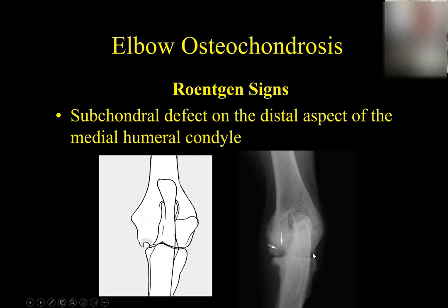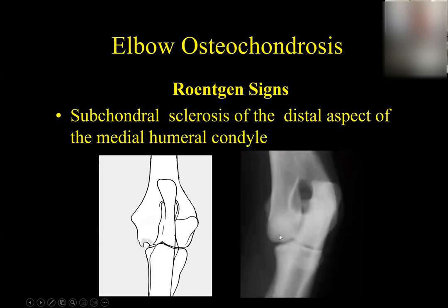Again, you can go in arthroscopically, try to clean that out, clean out the joint, and get rid of any mineralized or cartilaginous fragments floating around in the joint. If you don't do anything, the dog will start to get osteoarthritis or degenerative joint disease. This dog already is getting it. Here's another very subtle lucent lesion, but you can also appreciate it's a little flattened here, maybe a little concavity along with that subchondral lucency. And the other thing I will tell you, again, it's a common thing, is that unless you shoot really good quality radiographs that are exposed properly, you'll miss these lesions.